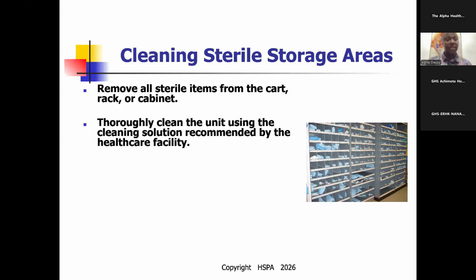I went to a facility, and when I used the white cloth to clean, it was a disaster. So please, sterile items are what we're talking about. Even the utensils that you use in your houses, when you clean them and put them in a cover, when you are going to cook, you clean them before you cook with them. Let's use that same concept. The food that we are eating, we boil it, yet we still clean our utensils. How much more for things going to these vulnerable, infected patients? We have to keep them safe and sterile.